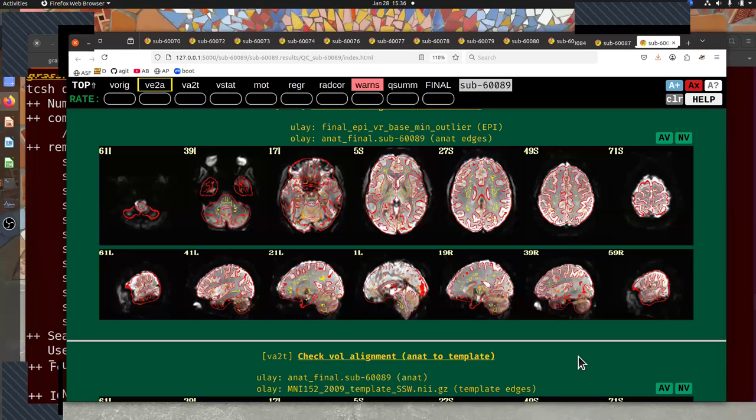If something is wrong, sure, I can take more time on it, but then I need to take more time on it. And that's really how quality control works. We've tried to make the QC efficient and preloaded with so much stuff. So you can just check it, and if things are fine, great, you're not spending a lot of time on it, and now you know. If there is a problem there, you have to spend time on it, and now you know.